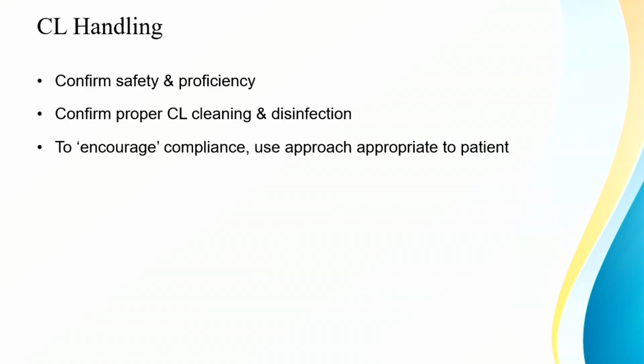The storage is an important point: you need to store it in fresh solution, not in the old solution in which you kept it the previous day. And one more thing, you can't top up the solution on top of the old solution. You have to throw the solution out and then fill in fresh solution. And when the lens is on the eye, the lens case should be dry.